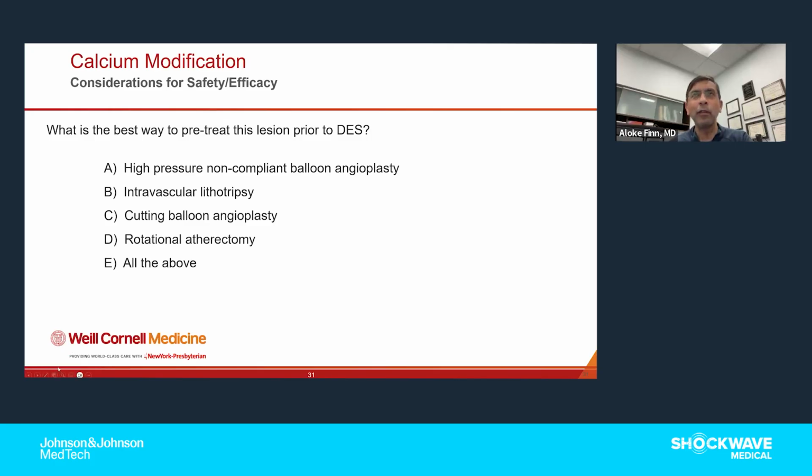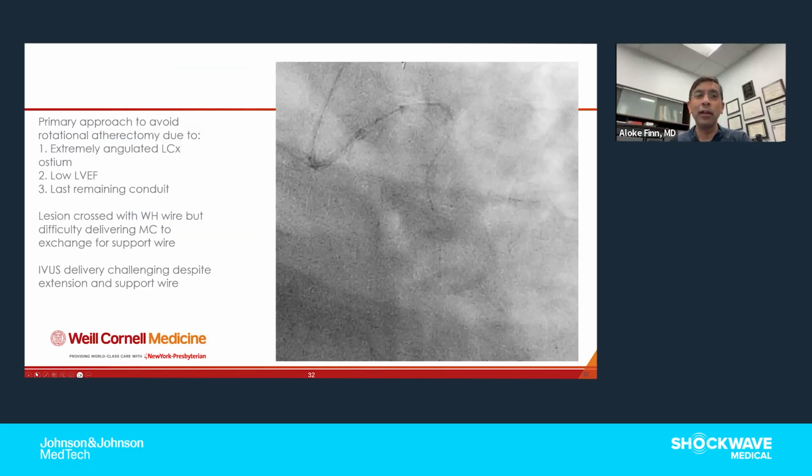Yeah, I am in full agreement with that. My experience is that if I can get the IVL catheter across, and that's the issue for me, if we can get it across, I will certainly use IVL first, because I just think it's the safest. But if I can't, then I might go rotational. But obviously, this guy is low EF.